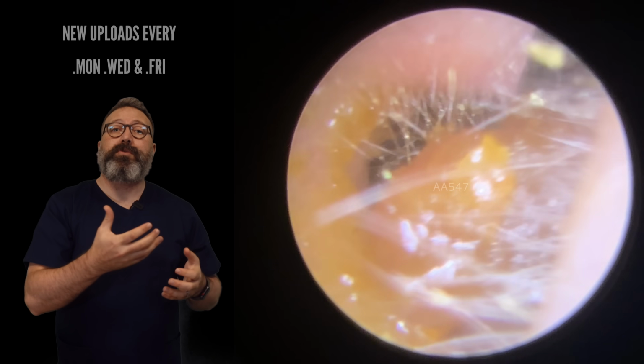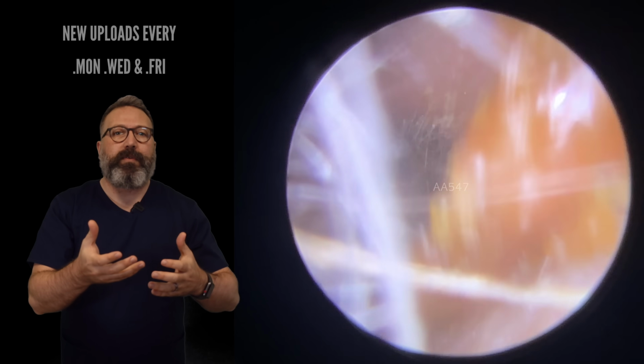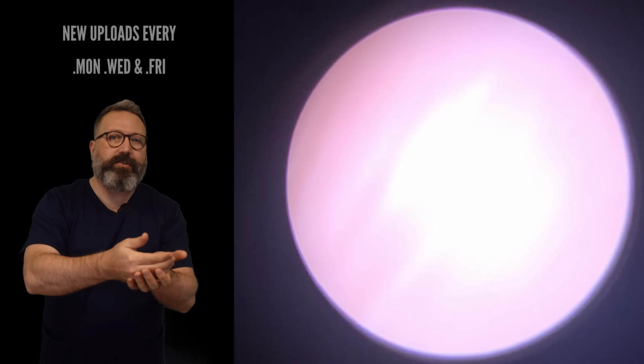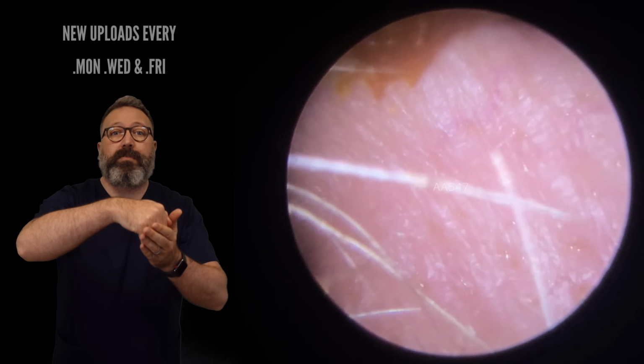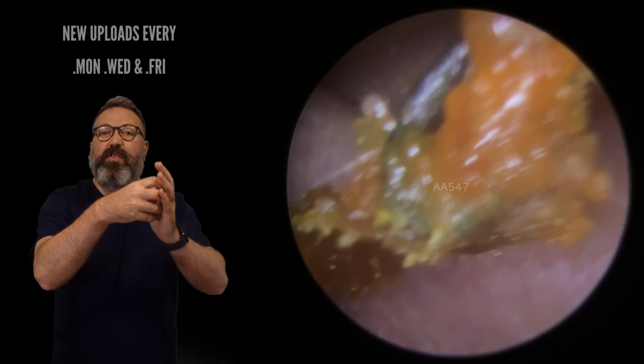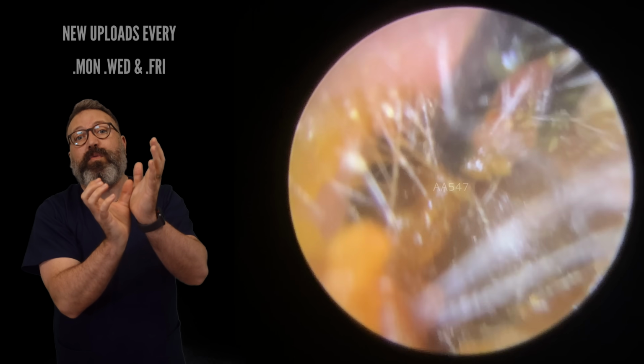So you can see I've got the Jobson horn in here, trying to bring this forward, and what's happened is exactly what we thought was going to happen. As soon as we broke through that surface layer and tried to roll this wax forward, that's all it's done, is punched through the surface layer, and then because the middle's all soft and squishy, as we pull out, it's just peeled away and it's just sort of folded forwards.